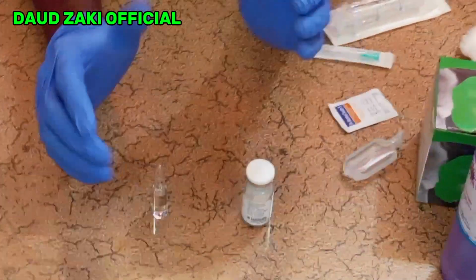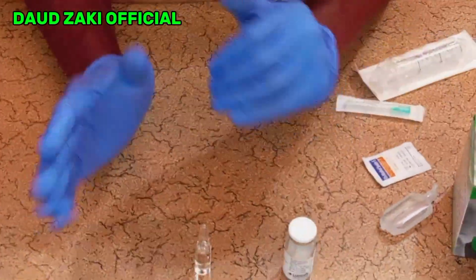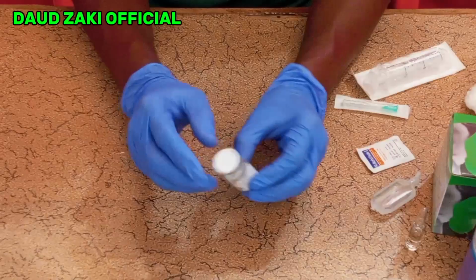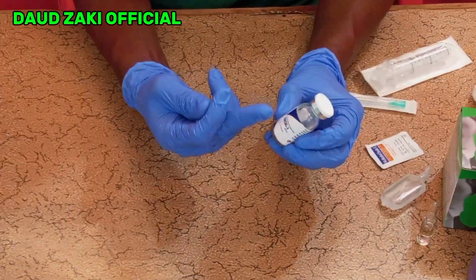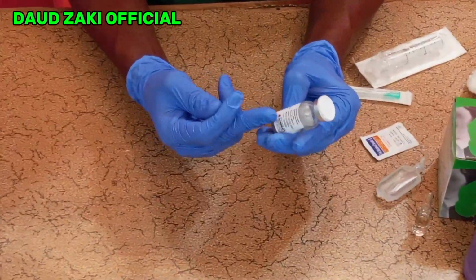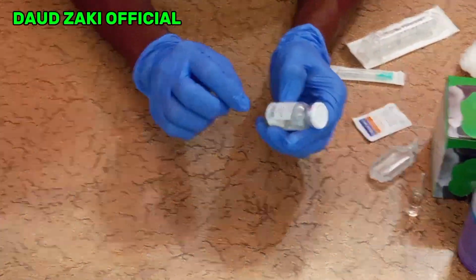I want to show you how you can dilute, how you can reconstitute the drug correctly for you to administer safely to the patient. Okay, let us start with the vial first. Before you start diluting the drug, make sure you read the instructions of the drug. You have to confirm the name of the drug. You have to confirm the method of administration, that is the direction for use, either IV or IM.